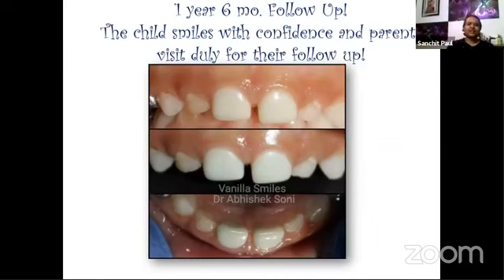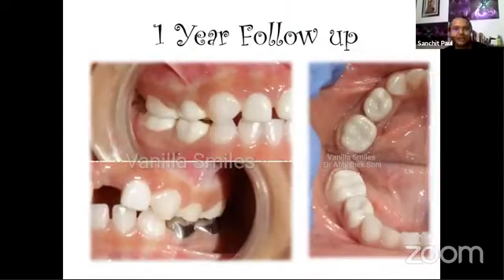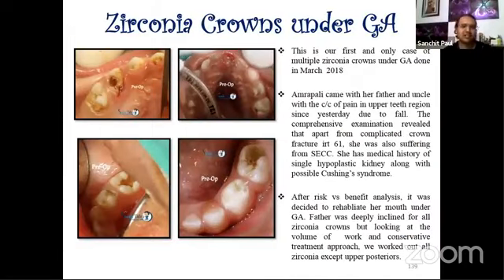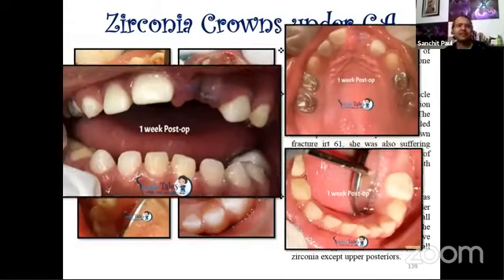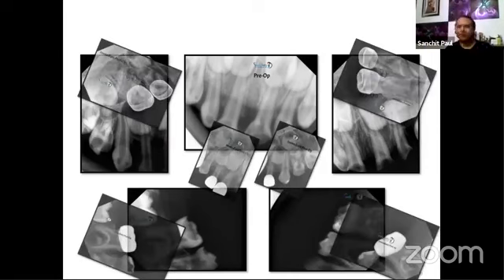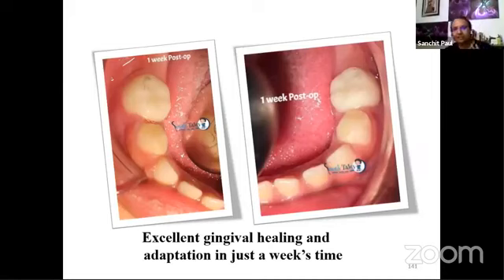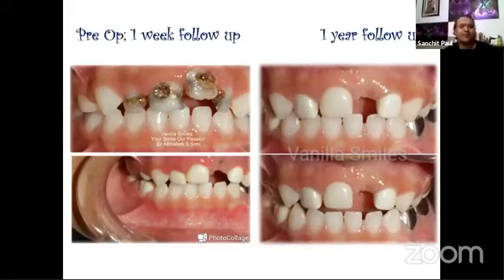But one thing we can safely say is that one cannot really differentiate between a primary natural crown and these, and one can see the difference between how a steel crown conventionally looks and how these tooth crowns actually look. So we do these crowns under GA, and we do these crowns every day under nitrous oxide. Again, posterior crowns can be debatable in terms of parental acceptance and parent affordability. But for primary teeth, as we mentioned, these are no-brainers, unless the tooth really cannot hold a zirconia crown. See this picture, this case of Dr. ABHISHEK, we really love it.